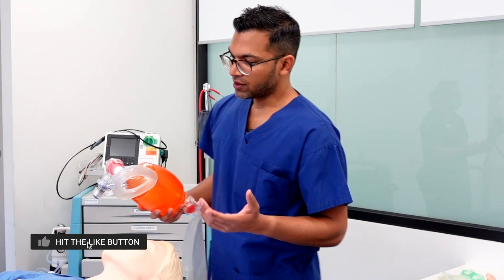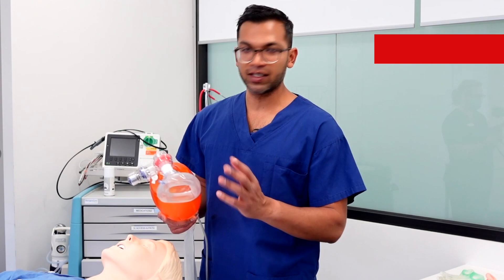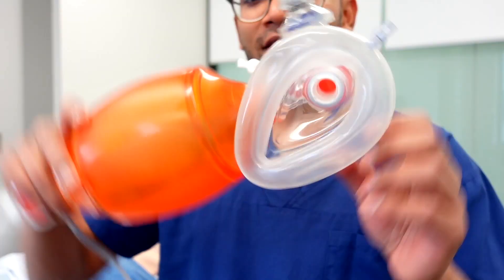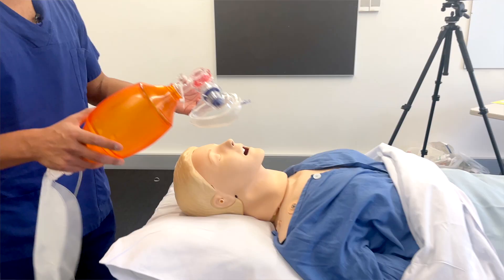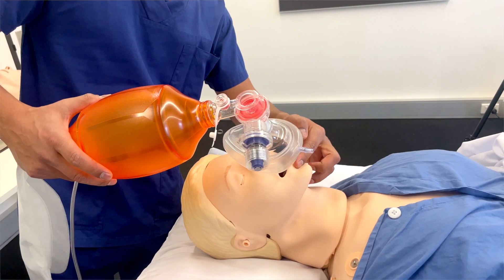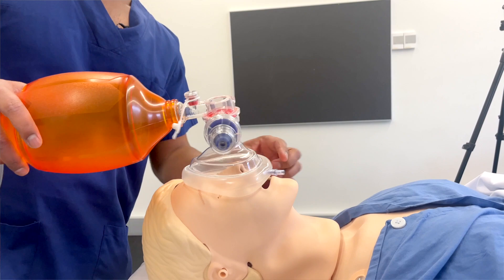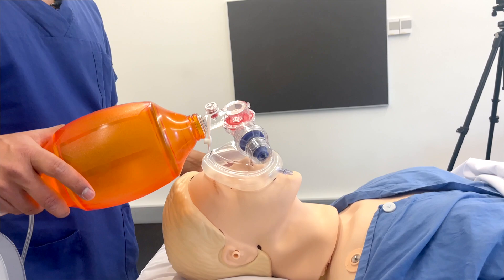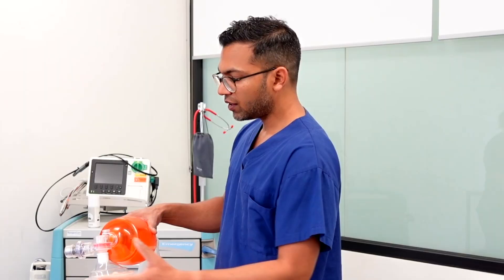Now, how do we get a good seal? Each face mask is slightly different, but I want to give you the principles so you'll know how to fit any mask. The pointy end goes on top of the bridge of the nose and the flatter part sits just in the groove above the mental prominence. If the mask is too large, it hangs over the edge and leaks; if too small, it won't cover the mouth properly. Your mask should fill the bridge of the nose and the groove just above the mental prominence.